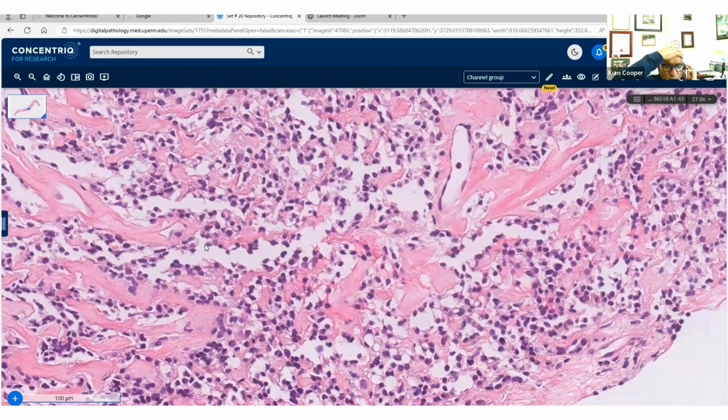And then always don't forget UTROSCT. UTROSCT is always something that has such a heterogeneous morphology that you can sometimes misplace them. So the way I do it is I think about mesenchymal markers, that's actin and desmin, and then epithelial, keratin, usual favorite keratins, and then sex cord stromal, which is steroidogenic factor 1 and inhibin. Those are my markers I like to use for the UTROSCT.